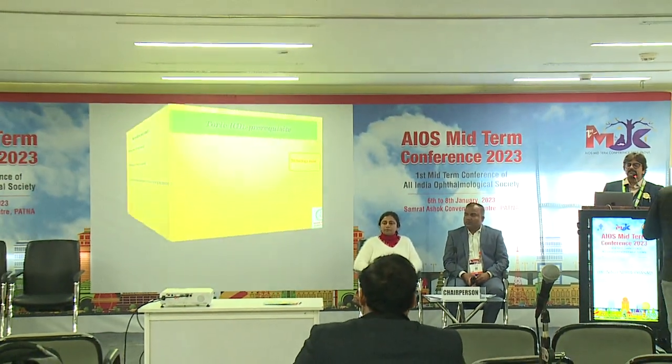As you know, modern cataract surgery is more of a refractive surgery, and myopia and hypermetropia can be corrected using appropriate spherical power of the lens. But 20% of patients who undergo cataract surgery have more than 1.25 diopter of corneal astigmatism, which is visually significant after the surgery, and they are very unsatisfied if you don't correct it. The best way to correct is by implantation of the toric IOL. So, how to achieve the perfect result? Technology and surgeon technique, and a combination of both, achieves the best outcome.